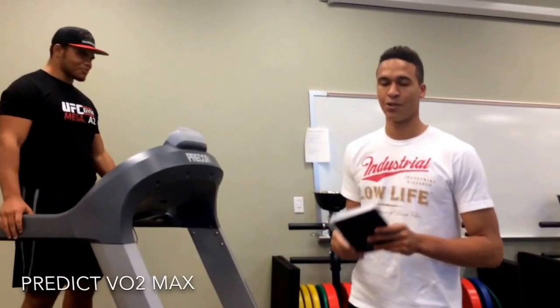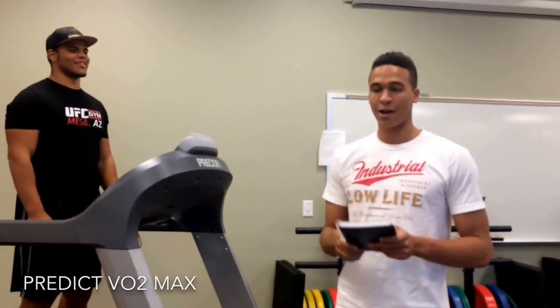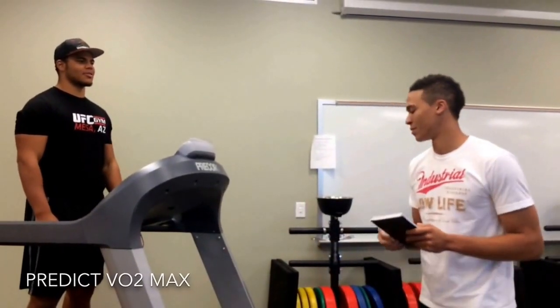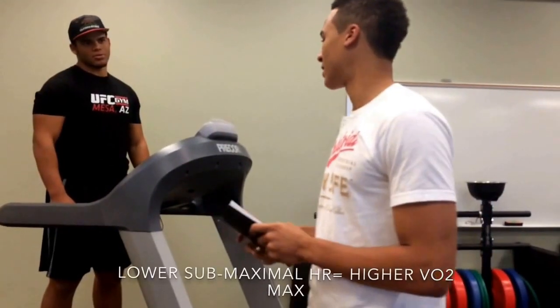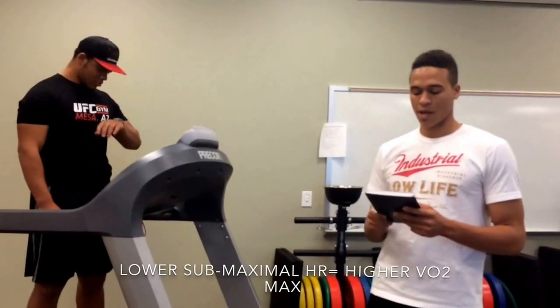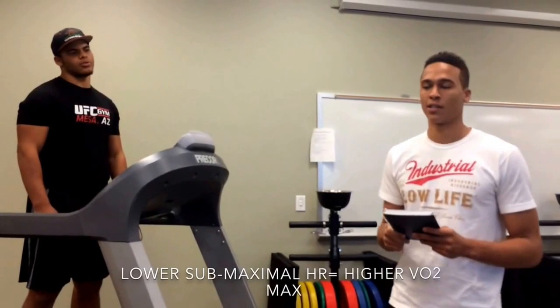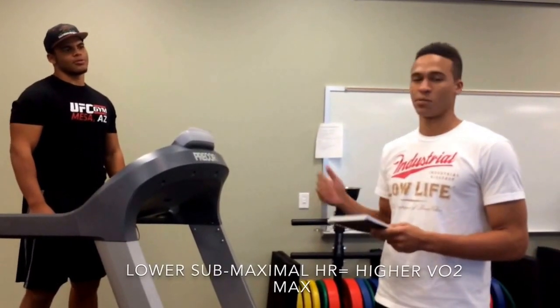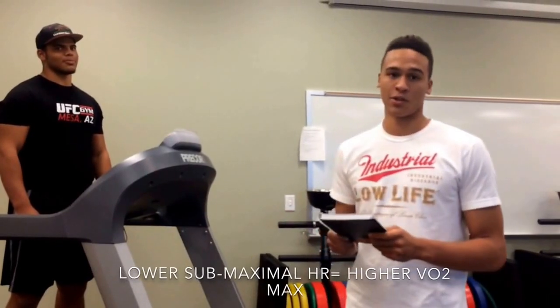The purpose of this test is to assess cardiorespiratory fitness, and we use this test to actually predict the VO2 max. What occurs during this test is that as the intensity and the grade goes up, the heart rate also goes up, and the intensity of the heart rate lets us know how well his muscles are using oxygen, and in turn lets us know his VO2 max.